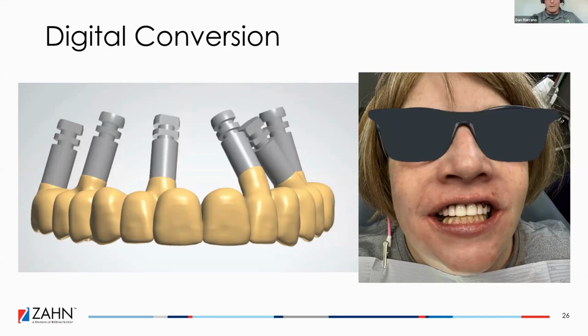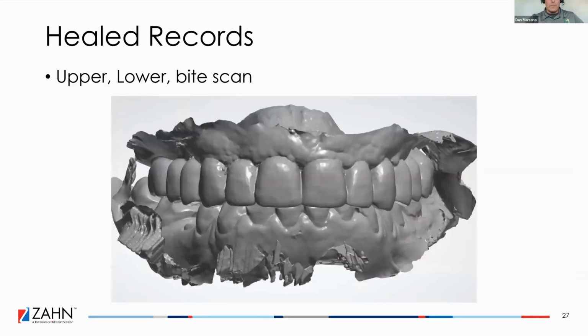She was ecstatic. We got rid of the gummy smile. The design is pretty much straight. And what you'll find is you do a good job on these designs and you nail the surgeries, the revisions are so much easier. You're not doing full-fledged redesigns. And a lot of times we even skip another prototype or trying. We're going direct to final because we're just matching up what we did on the surgery.